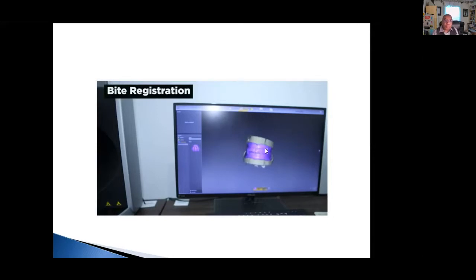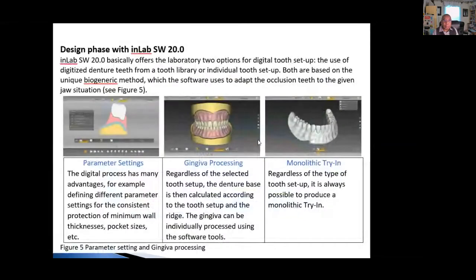Right. So Chris will be very interested to see how this can be done digitally. I'll be discussing with Dr. John because he was giving us some kind of feedback. I want to see how this can be done without going through analog, so that we can have a full-fledged digital workflow. Here we are just trying to establish the bite registration, and thereafter we'll move on to select the system based on how we set the parameters. The system will present us with some initial solution, which we have to work with, depending on what we are looking at.